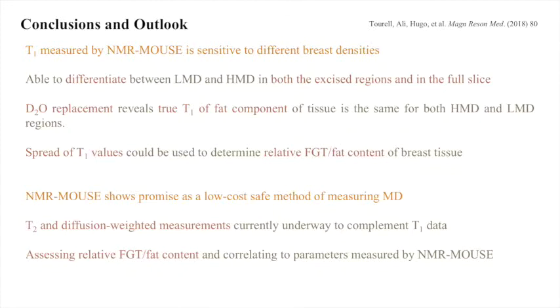Portable NMR appears as a promising approach to the assessment of mammographic density without using ionizing radiation. More generally, we believe it could potentially become a new paradigm of biomedical imaging in applications where spatial localization rather than fine spatial resolution is required.